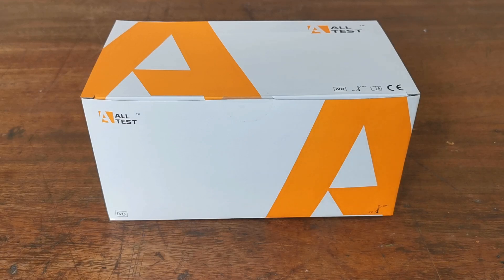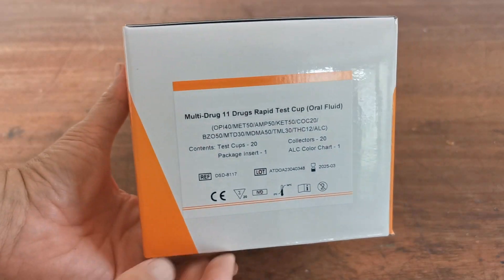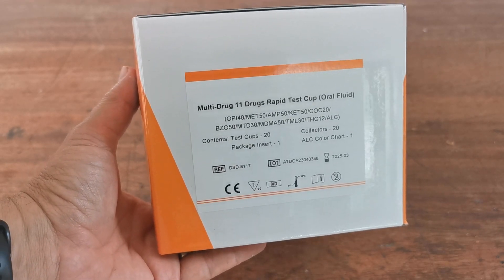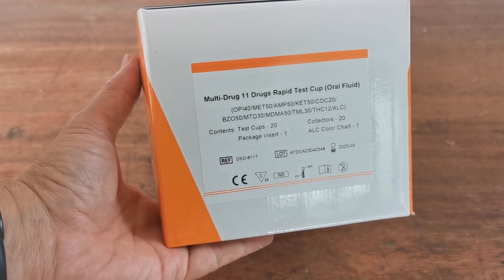Welcome to this combined Value-Made-in-UK drug testing product demonstration video. We're going to run you over these new 11-drug saliva drug tests made for us by AllTest for the UK Drug Testing website — a combination of 10 drugs plus alcohol.